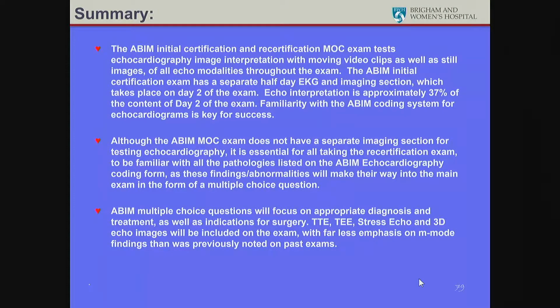So in summary, I've presented you with a lot of clinical vignettes that are typical of the types of images and questions that you will see on your ABIM initial certification as well as maintenance of certification exam. The ABIM exam, both initial certification and recertification, tests echocardiography image interpretation with moving video clips as well as still images of all echo modalities throughout the exam.